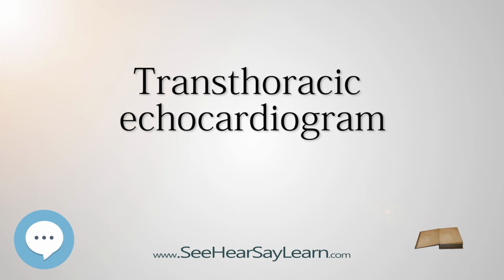Transthoracic echocardiogram risks. There are some risks associated with having an echocardiogram performed. It is possible that the images will not show up clearly enough, which can cause a misdiagnosis. This type of echocardiogram can also miss certain parts of the heart that cannot be captured.